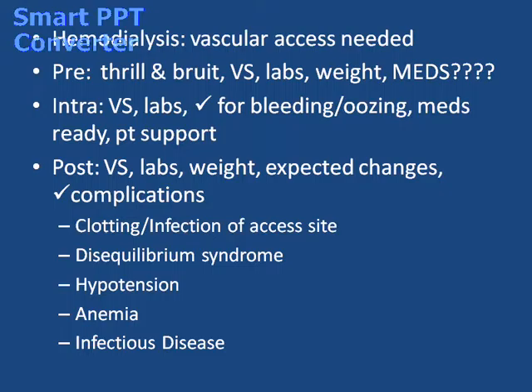So during that procedure, we're going to keep an eye on vital signs. We'll pull lab values off while we're dialyzing the patient. And I'm speaking we as in the dialysis nurse, because typically if you have an acute patient in the hospital, the nurse comes to the patient and it's not the bedside nurse that's doing dialysis.